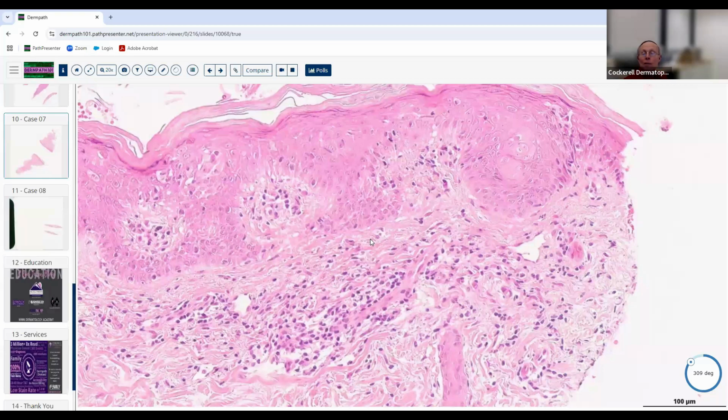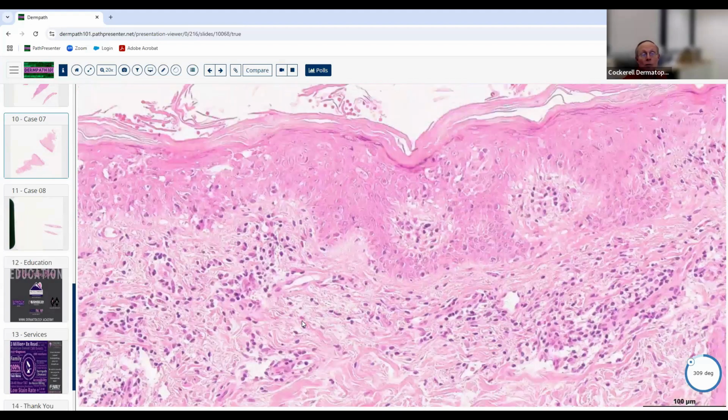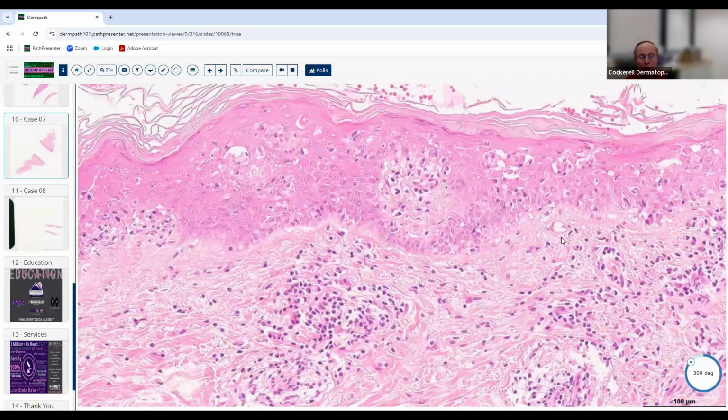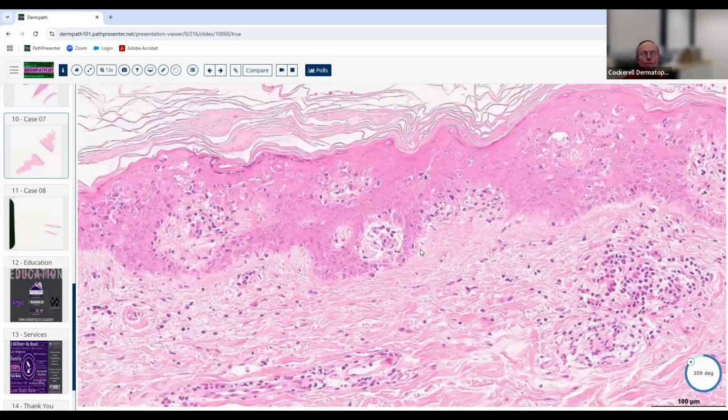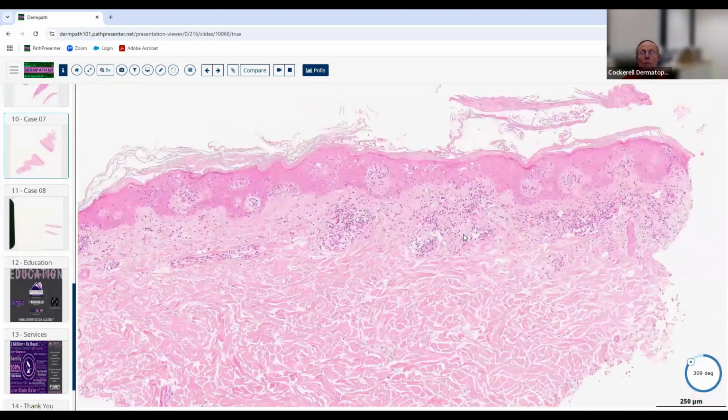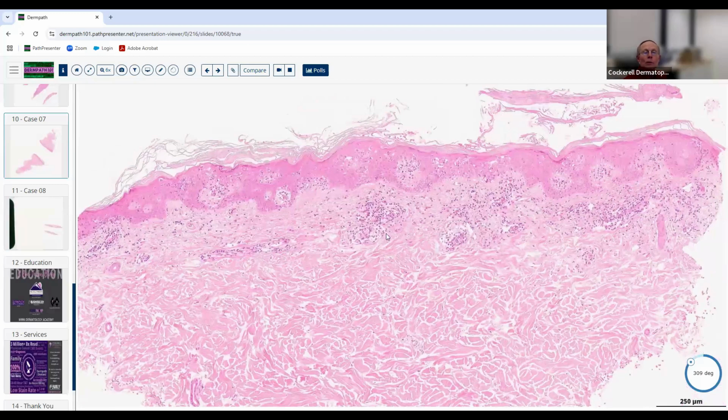By the time it's biopsied and the diagnosis is made, you'll usually see some of those abnormal changes in the collagen and the blood vessels. So that's characteristic. And that's often associated with the poikiloderma that you see clinically, with the atrophy and the telangiectasia and other changes. So good. MF, and that's the differential. It's a fairly short differential of things to think about.